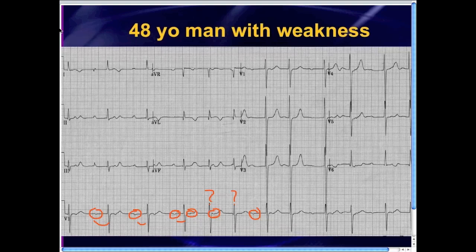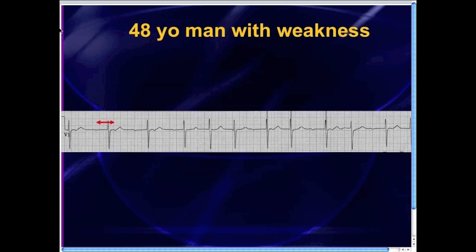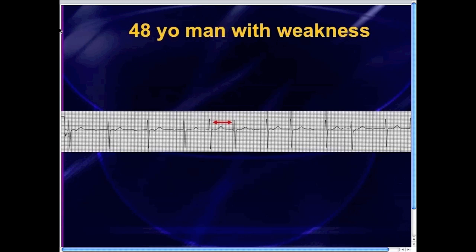Whenever you've got blips and you're thinking maybe those are P-waves, the simple way to find out for sure is to get some calipers and map it out. These red arrows represent my calipers. I'm going to map out the definite P-wave with the questionable P-wave and march this right across the EKG strip. Sure enough, the clear-cut P-waves map out with those blips all the way across the complexes, revealing that the junk right there is a P-wave, and also that the blip right after the QRS complex and the blip before that QRS complex are P-waves as well.